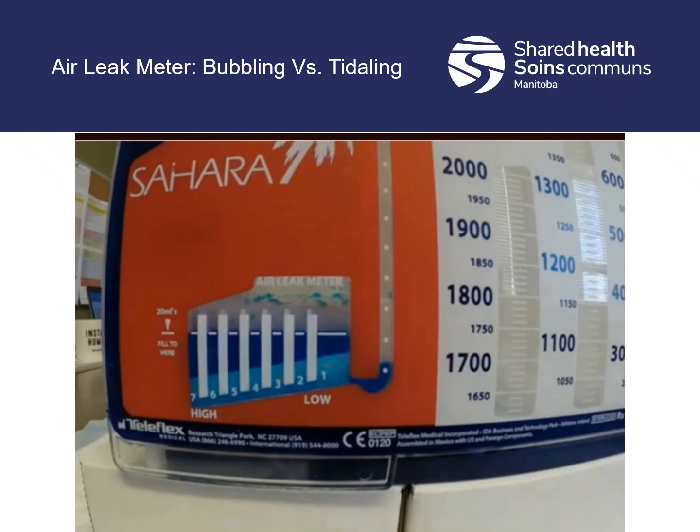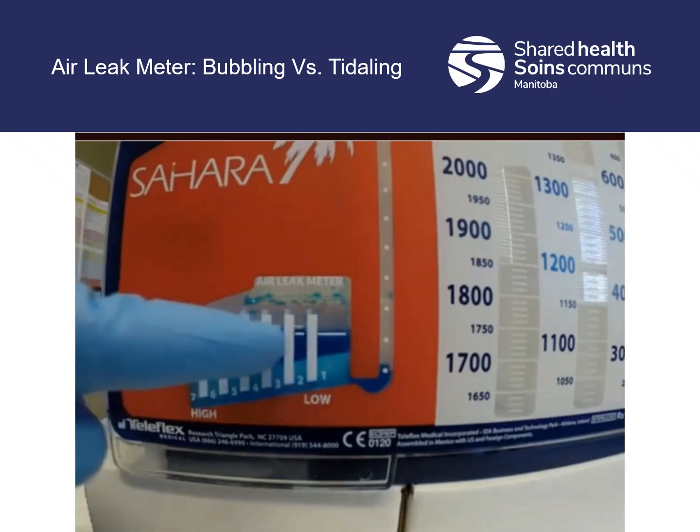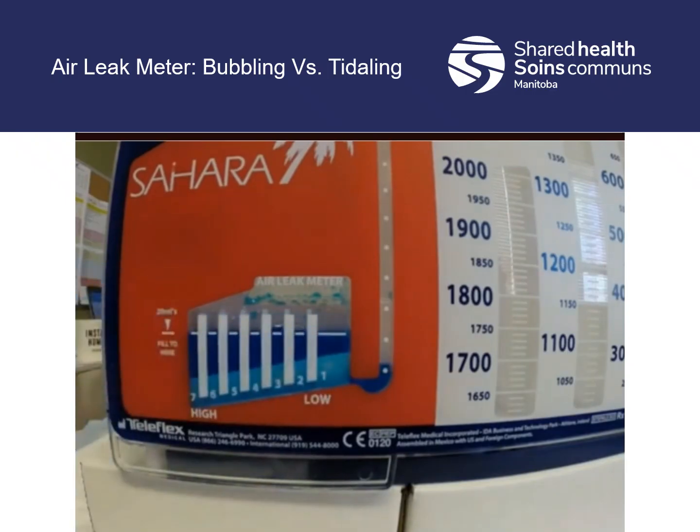So when we look at the device here, see air goes in, there's a lot of bubbling there, so it's going up to about 3. That might be normal. Might be a small air leak from the lung. But if we have something like the tubes come dislodged, things like that, we could have a lot of bubbling. So you can see it goes all the way up to 7 there. So that is excessive bubbling. That's not normal. So that tells us that there could be a leakage.